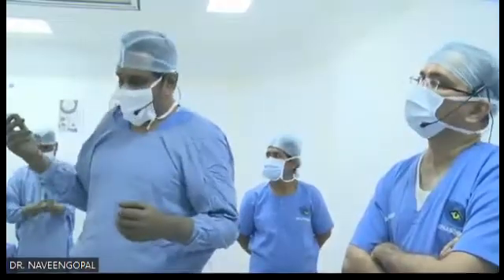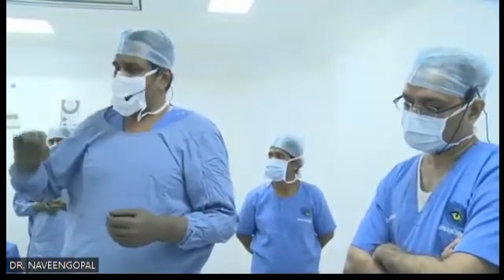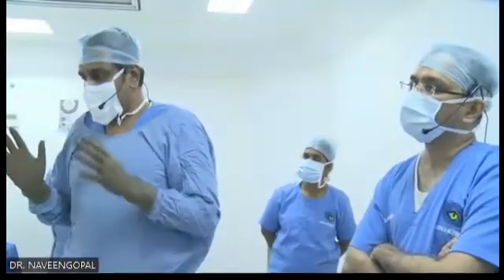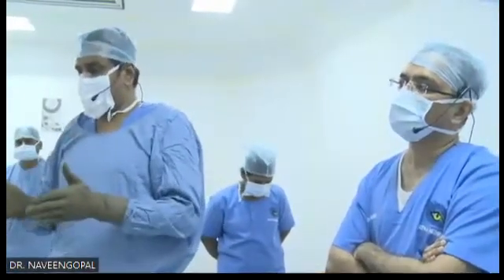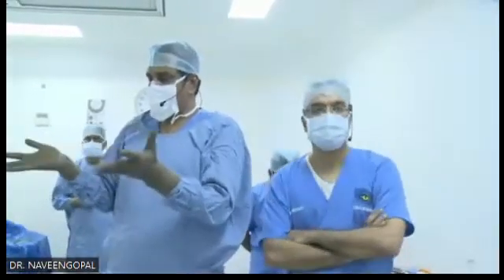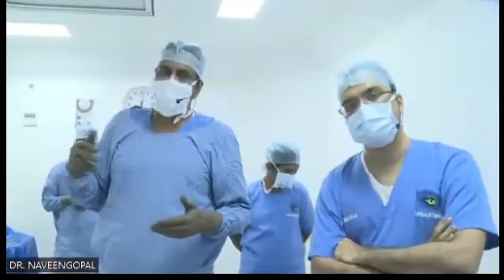She always used to tell me it's always a technical thing. You can learn it. The learning curve is very small. Be confident. You can put the ICL very easily. Just remember the principle: don't damage the iris, don't damage the angle structures, and don't touch the lens while putting. These are the very basic principles. If you remember, that is enough. The learning curve is very short compared to Phaco or LASIK.